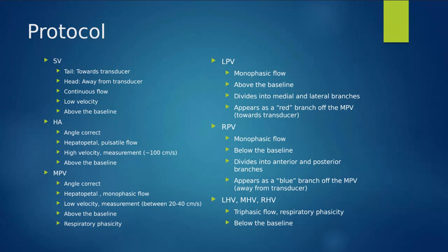And if we think about how this behaves to the liver, our portal vein is responsible for 80% of supply to the liver. Hepatic artery is responsible for 20. So that hepatic artery is going to be working double time to supply that liver. So we are going to see increased hepatic artery flow.